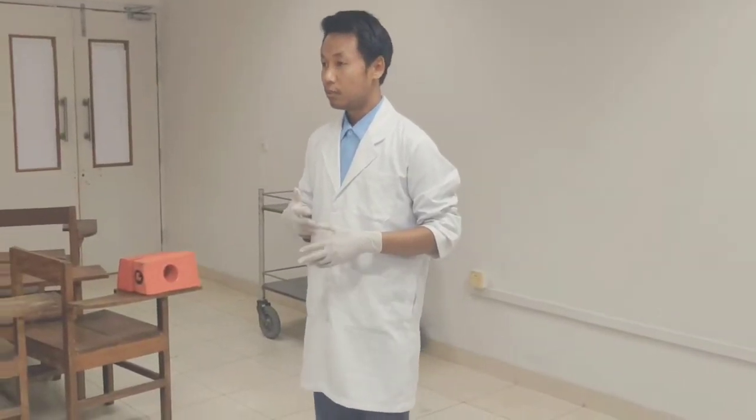Then we will assess the level of consciousness using the mnemonic AVPU. Then we will go for airway, breathing, circulation, and this procedure is done by look, listen, feel. Look for chest rise, listen for air passing, and then feel for a pulse. Then we will go for a rapid trauma assessment. For rapid trauma assessment, we'll go from head to toe using the mnemonic DCAP-BTLS. Now my friend Doji will immobilize the C-spine.